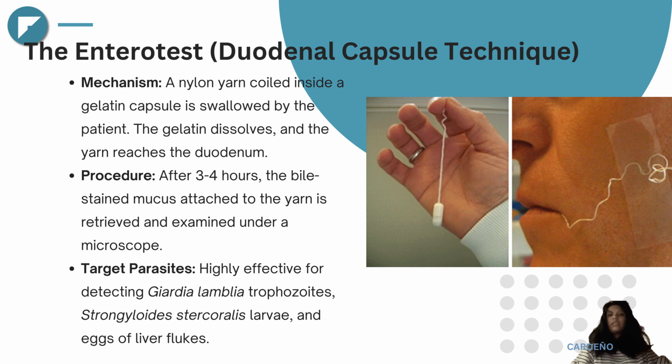It is highly effective for detecting Giardia lamblia trophozoites, Strongyloides stercoralis larvae, and eggs of liver flukes. Enterotest is particularly useful for diagnosing parasites in the upper intestine without requiring invasive procedures.